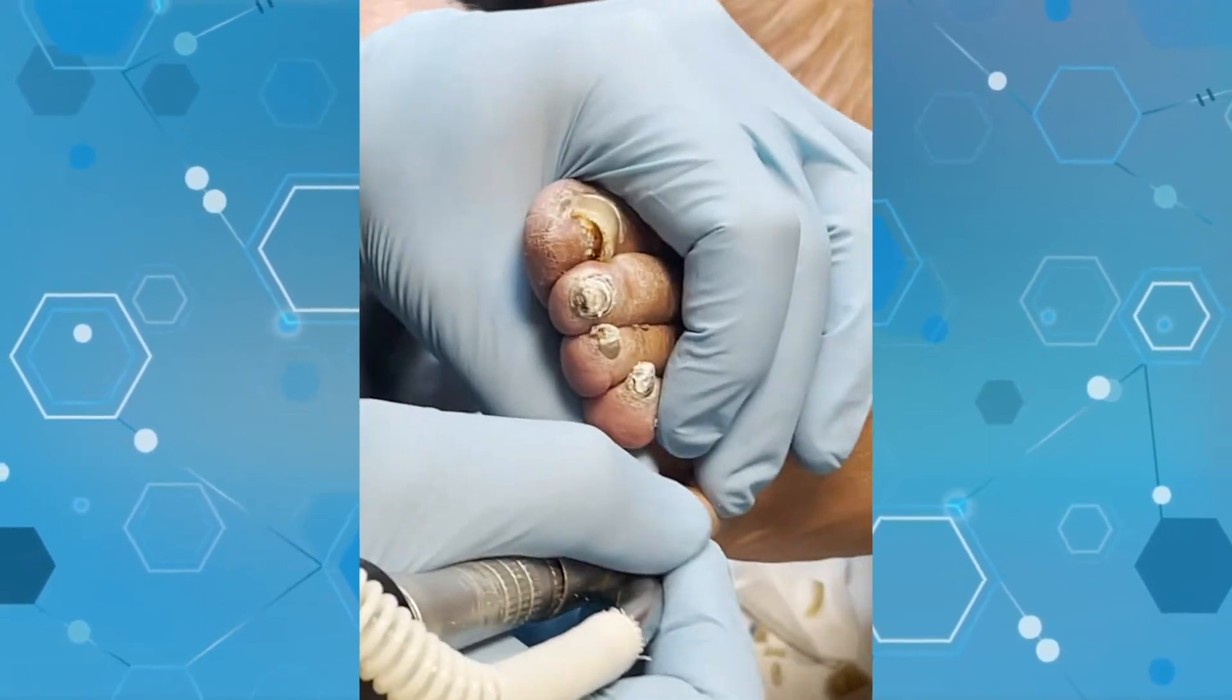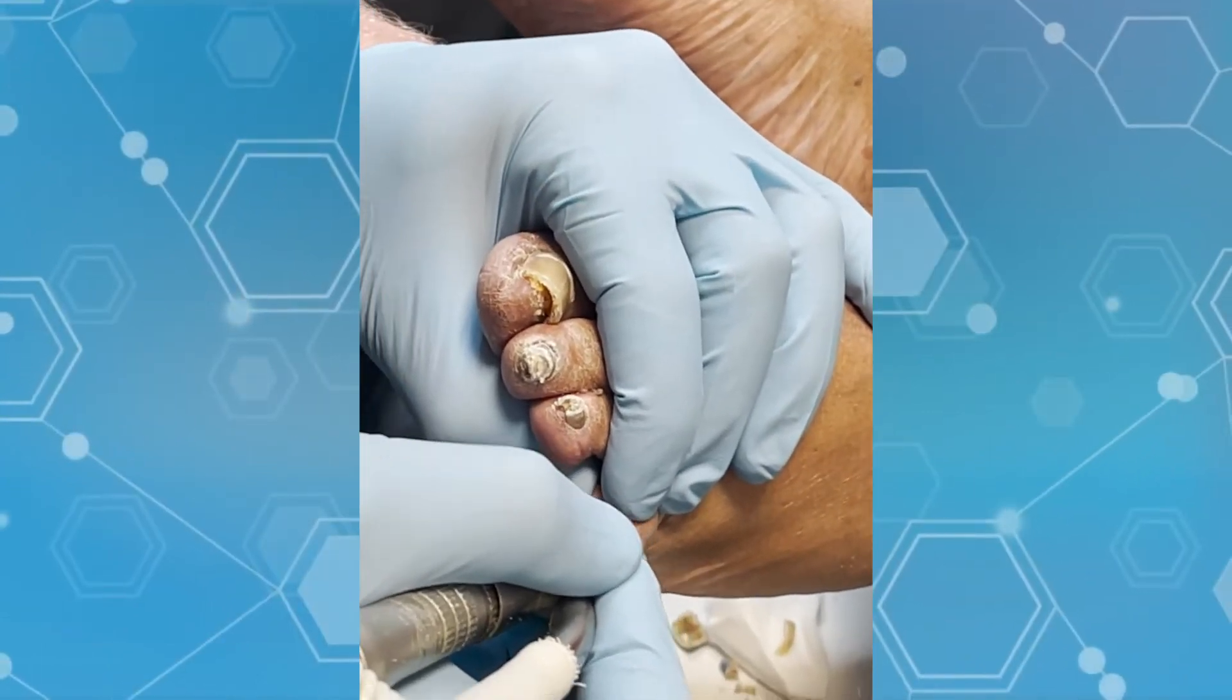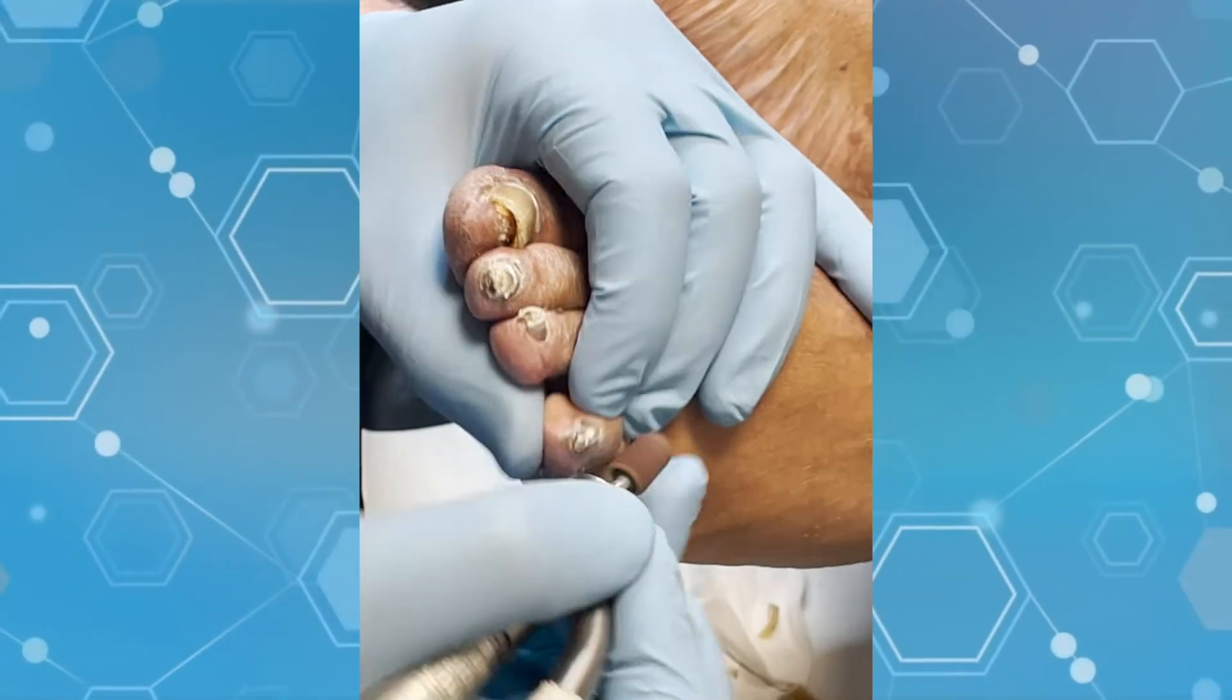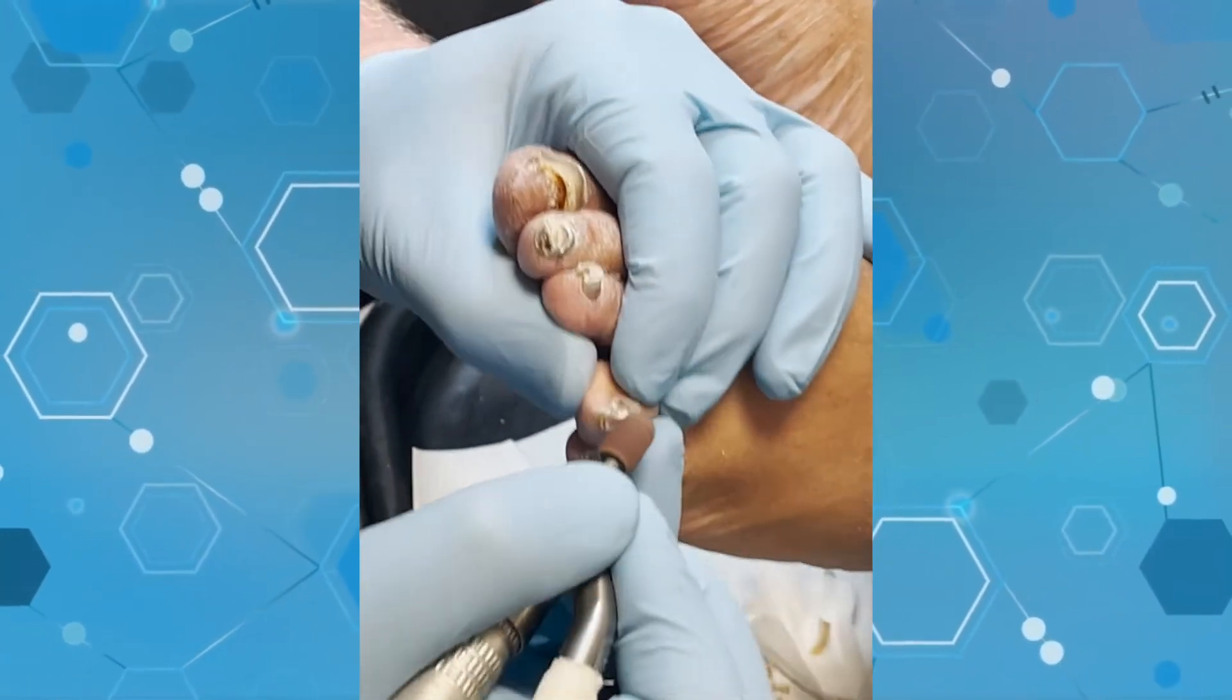She doesn't feel anything until you start to get toward her heel. That loss of protective sensation means that she is at a higher risk for any kind of diabetic foot wounds because she won't be able to feel.